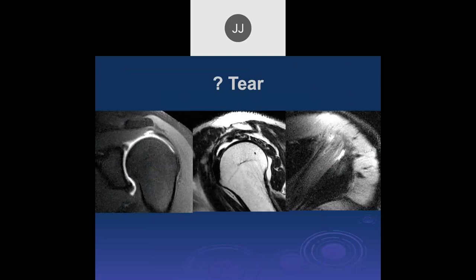Robert: looking at the musculotendinous junction, there's some increased signal on the coronal view — similar on the axial view. On the sagittal, there's also probably some increased signal there. That's an arthrogram study, so I think there's probably an articular-side tear. We can see a little bit of a defect going to the inferior surface, right in this area, and on the axial images it's this area here.